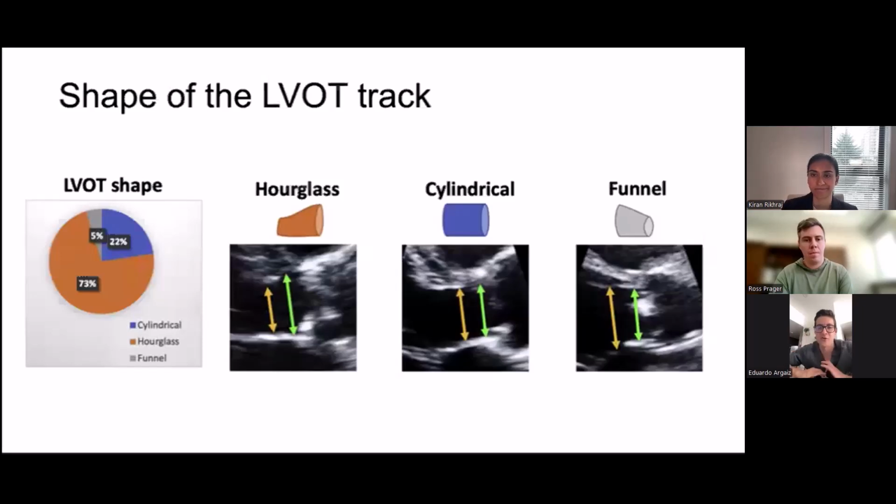And I think just relying on a single value was the mistake. But then even if you're relying on a single value and it's not perfectly obtained, and then you're ignoring other clinical factors such as pulse pressure, then you're going to get in trouble. And of course, this is what POCUS says, just another piece of the puzzle.